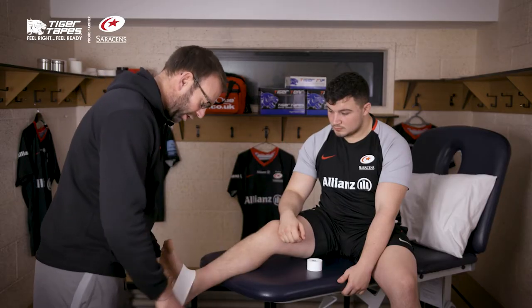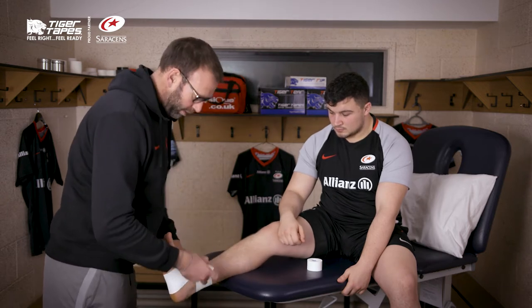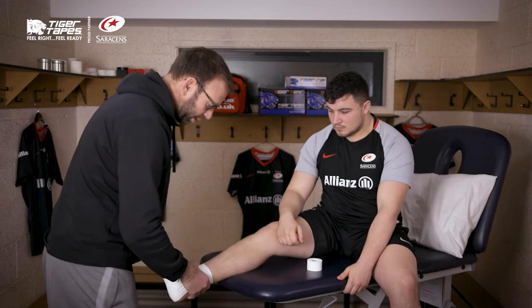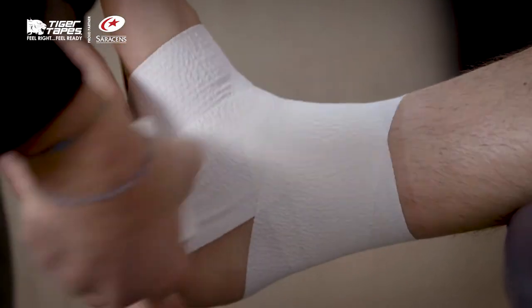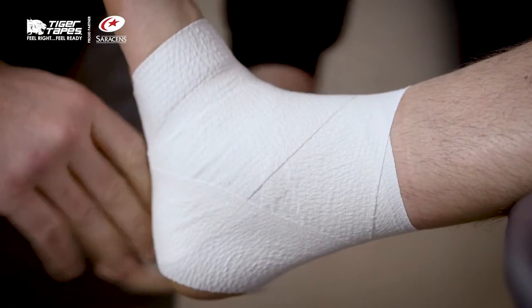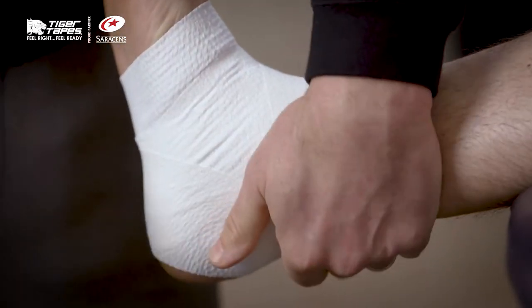It starts off as a nice strapping in itself and a nice base layer as well. Working around the ankle, putting the force on the lateral side. You can also use it to do a heel lock coming around the ankle, and that provides a nice base layer and a nice strap in itself.